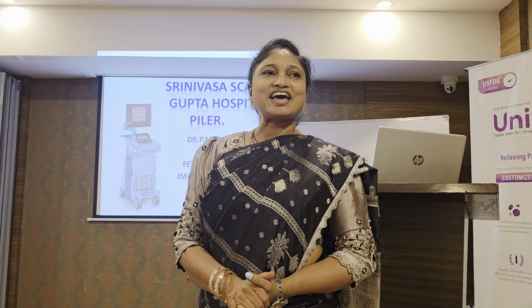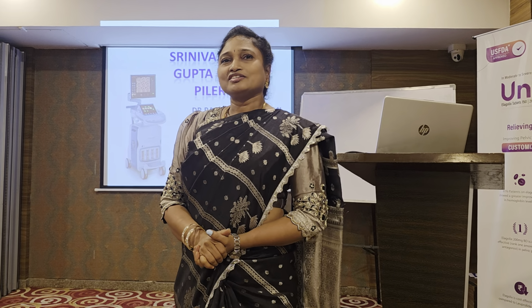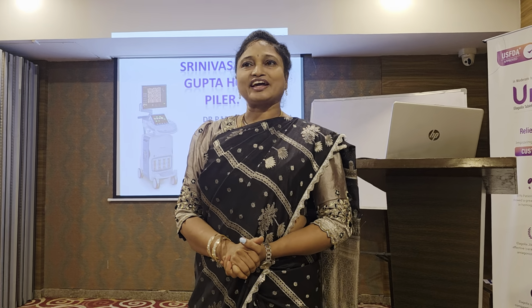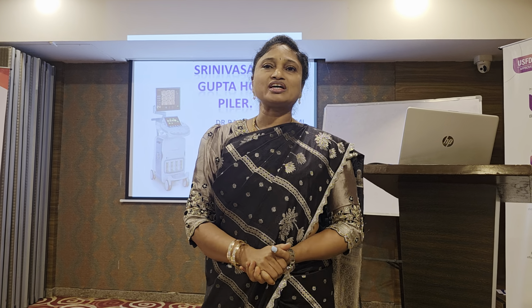Of you, how many are doing your own scans? Almost everybody is doing their own scans. Good. So it's just an extension of our right hand. That's what I feel, because it gives you an idea of what you're doing, what decisions to make. Without scanning, I'm totally handicapped as far as I'm concerned. I make almost all my decisions based on doing a scan, even if it's gynec, abdomen, or obstetrics.